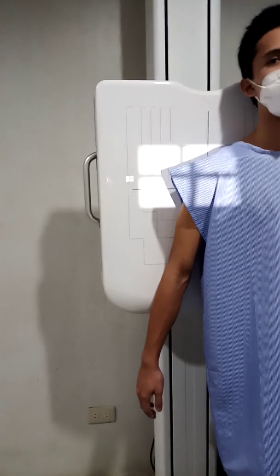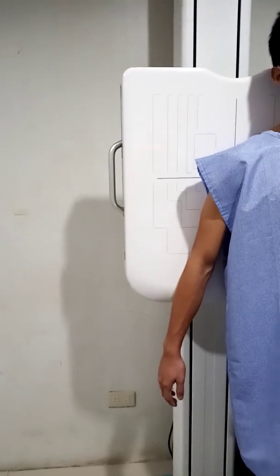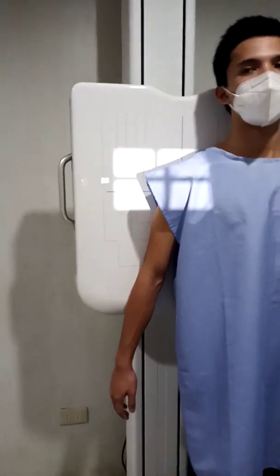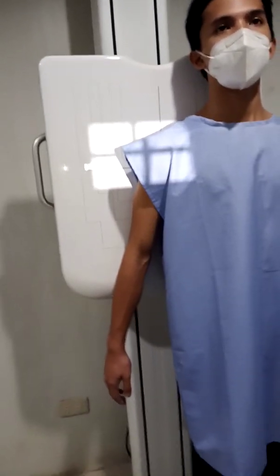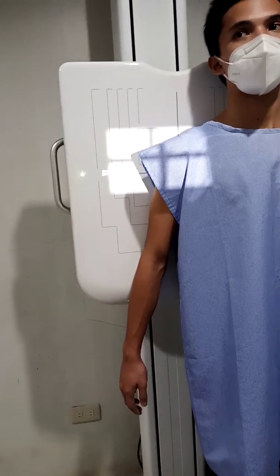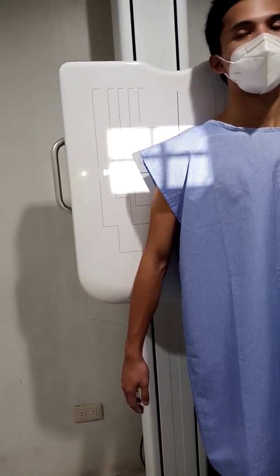Next one, if necessary to overcome the curve of the back and the resultant obliquity of the shoulder structures, slightly rotate the patient enough to place the body of the scapula parallel to the plane of the IR. So you can see the patient is on.